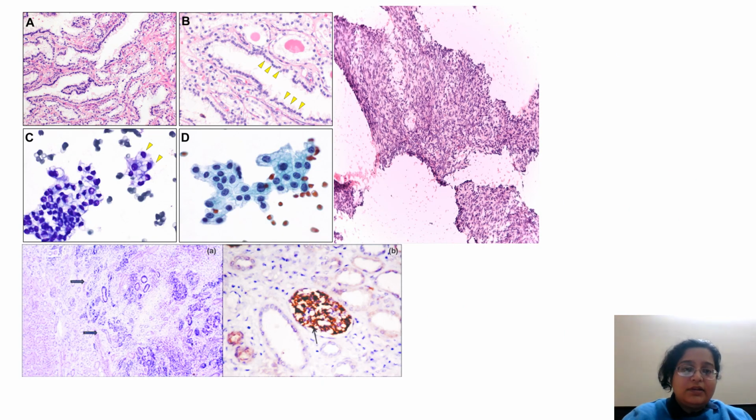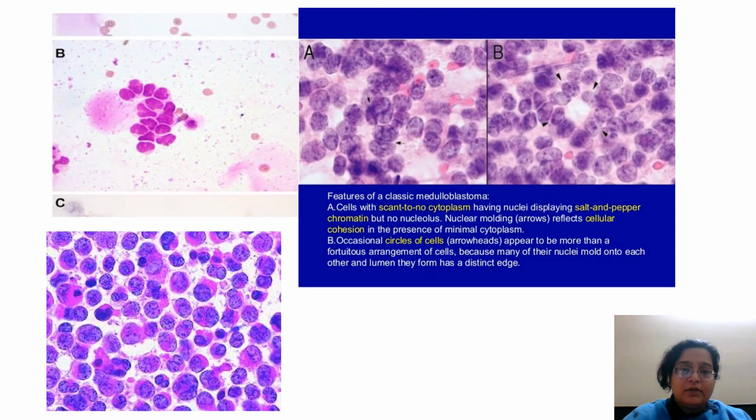Again, these are images. See, the clear cells have this kind of clear cytoplasm. Spindle cells will have spindle cell sheets. You can perform IHC to see what kind of material is there. And there is this kind of an indentation of the nucleus in small round blue cell tumors. Lymphomas will give you lymphoglandular bodies in the background. This is a medulloblastoma. You might get these rosettes in medulloblastoma. So these are things that you need to look for in a tumor.